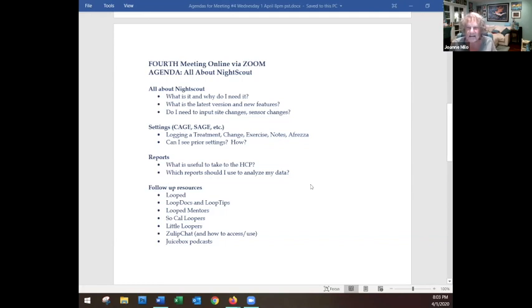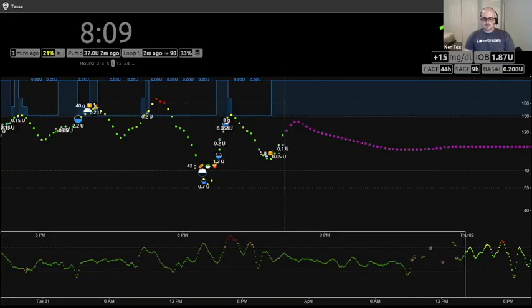We're good. Okay. Tonight we're going to talk about Nightscout. We are not. Kenny is. No, it's a we. It's okay. And what is it? Why do we need it? What's the latest version? Why do they call it funny names like ketchup? What do you have to do to run Nightscout, and how do you understand the settings? Also, what reports might you want to take to your doctor, if your doctor even cares? Mine doesn't, but if you want to dazzle them, what reports would you use?